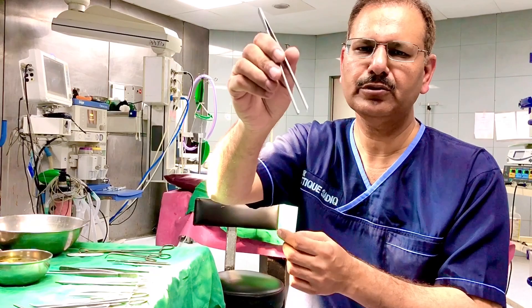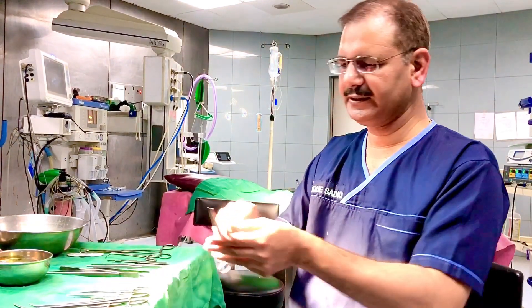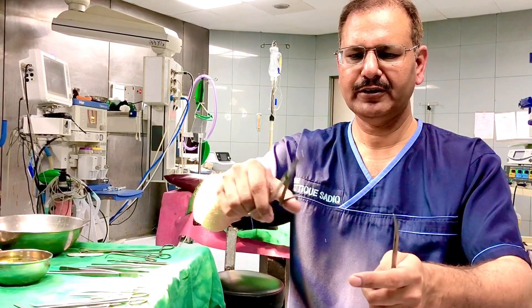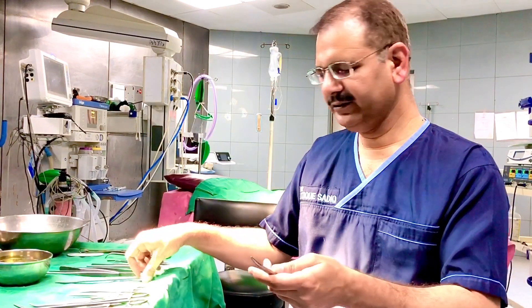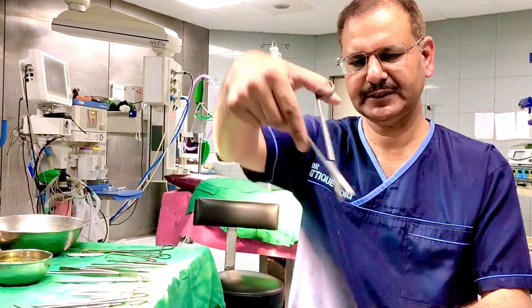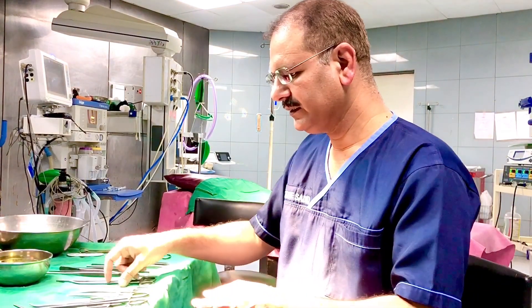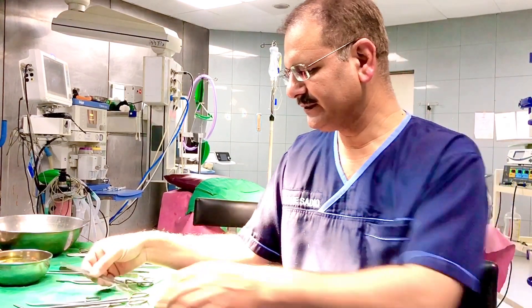These are the cutting instruments — the scissors. There is a straight suture cutting scissors and a curved fine dissection scissors. The dissection scissors is slightly curved and fine, making it suitable for fine dissection work.